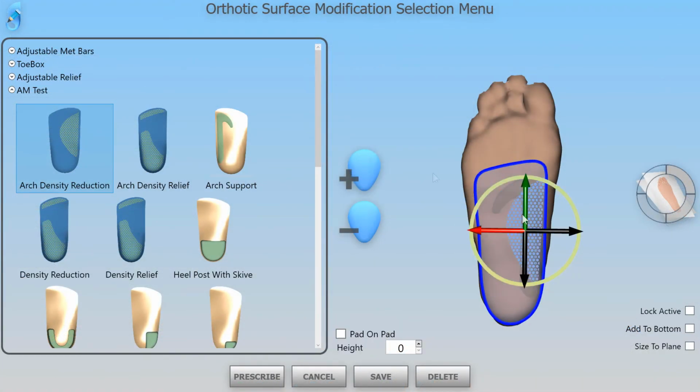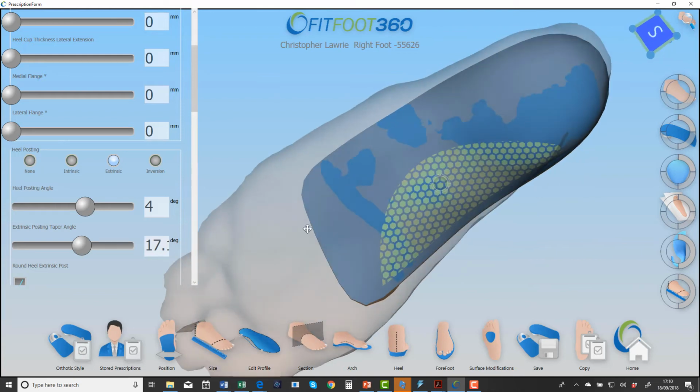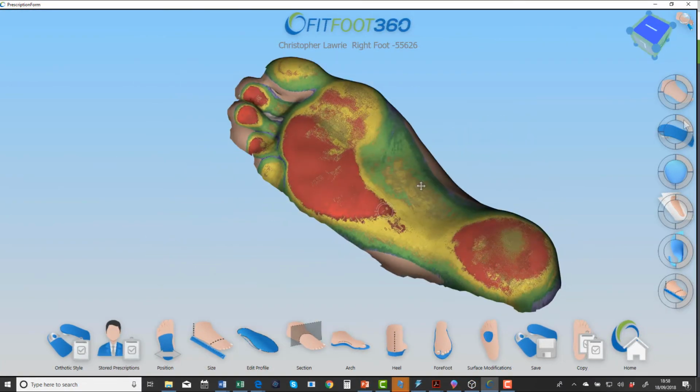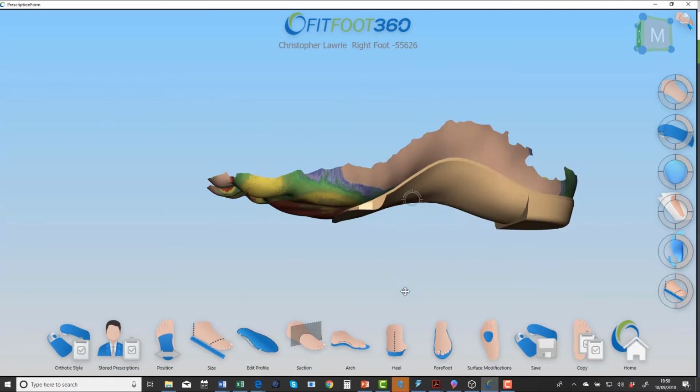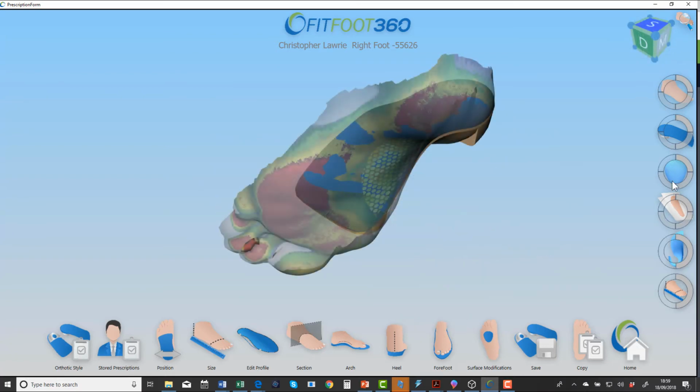Also here, we can take weight out. We can use features to punch holes through the device that will take weight out, but be careful, that can affect the quality of the product. But most importantly, at the end, we have a clinical device. It has a clinical top surface, but has been developed, engineered for 3D printing.